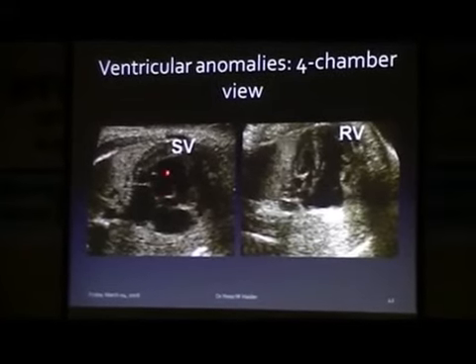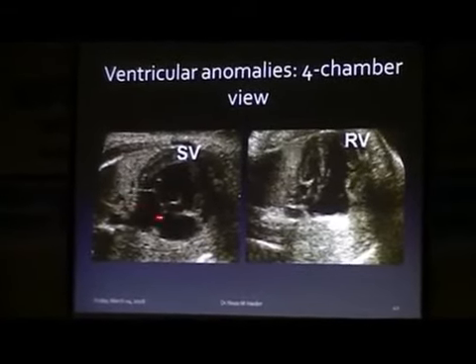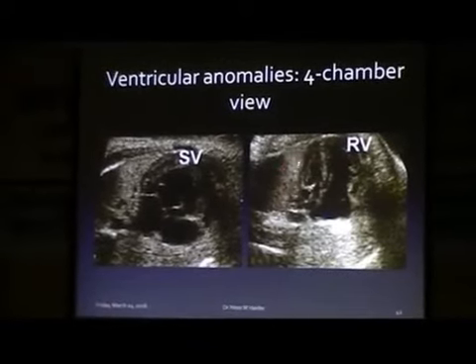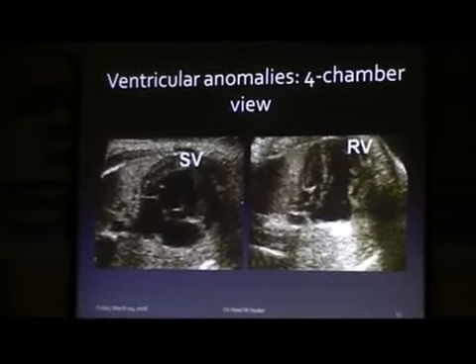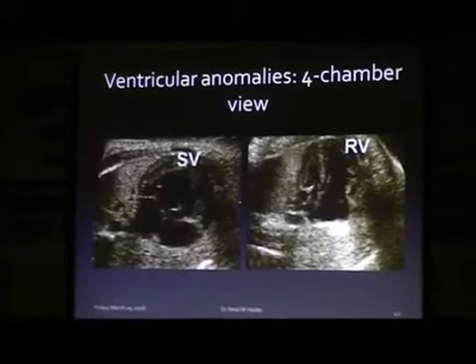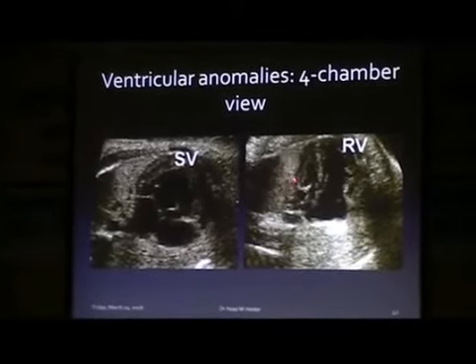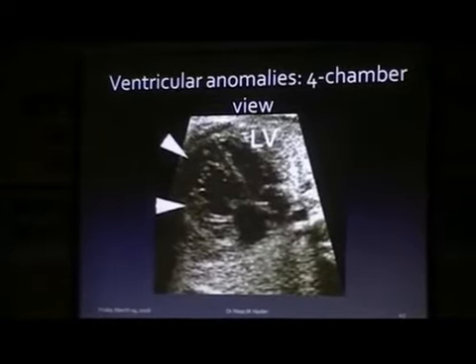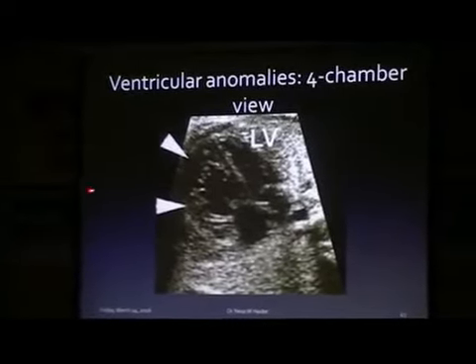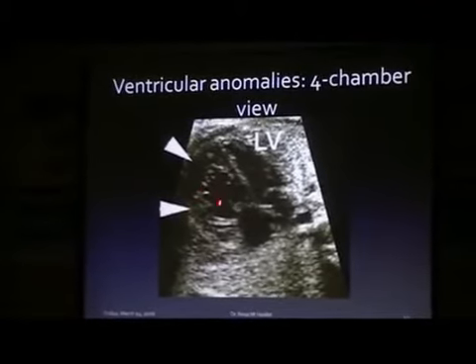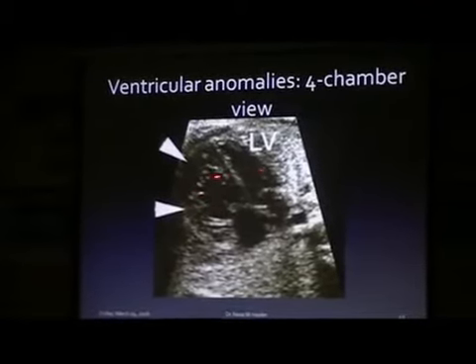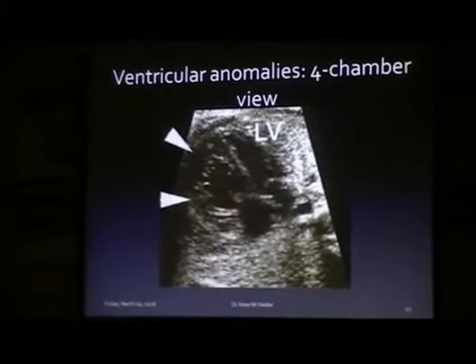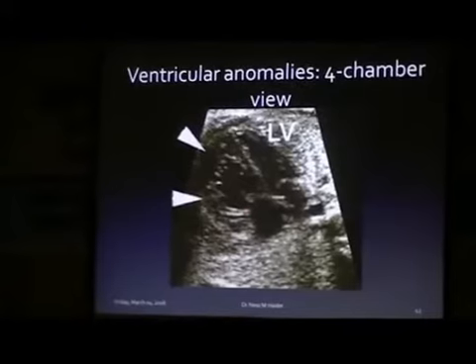This is a single ventricle with double atrium. And this is again one of the left ventricular hypoplasia cases — hypoplastic left heart syndrome. This is the right ventricle enlarged in comparison to the left ventricle, and it is an indication of coarctation of the aorta.